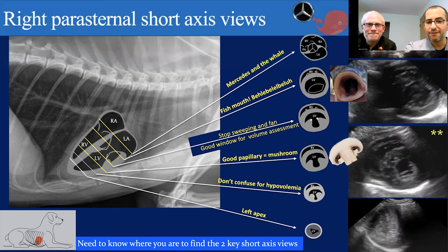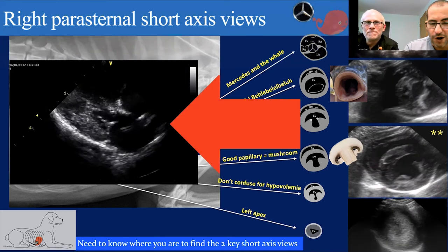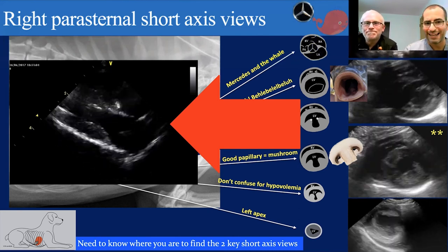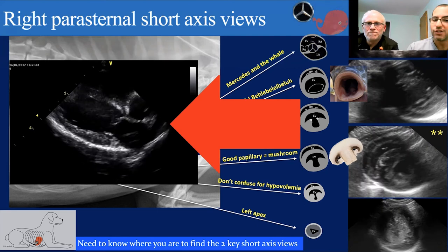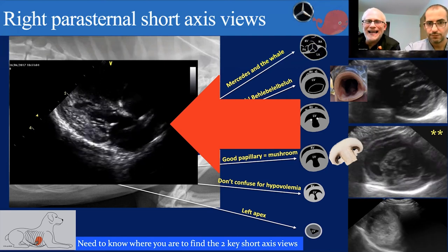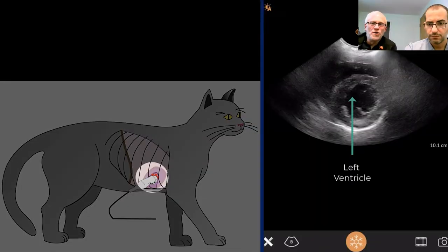Boysen. I love it. And then if you wanted that four-chamber view, long axis of the heart, you come back to mushroom and rotate your probe 90 degrees. This is definitely more challenging to get, Dr. Boysen. Absolutely. So we always tell people 95% of the time we can answer the questions we need to in the ER with just the short axis.